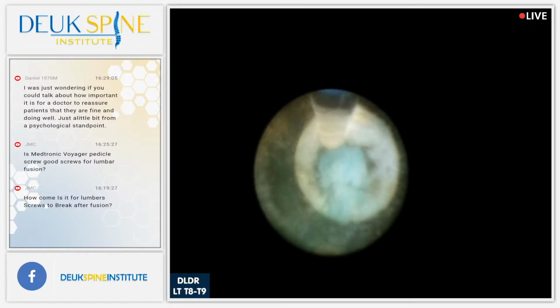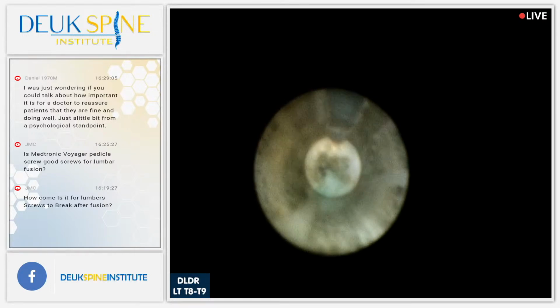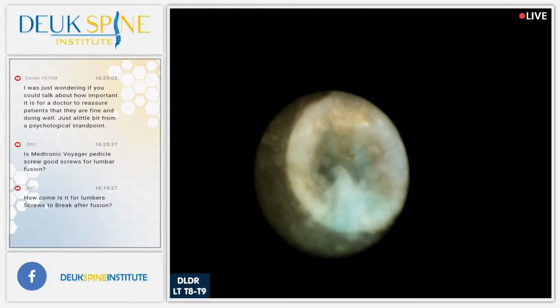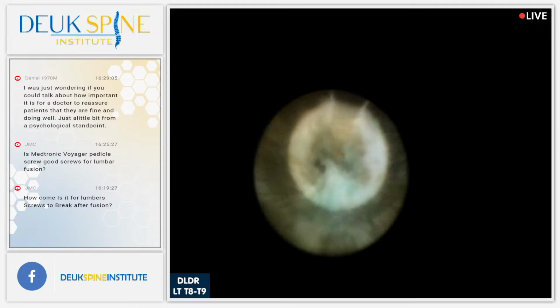You see the herniation right there? Yes, we do. Oh yeah, here it comes. So anyway, guys, why is the suction not on this bag? It's starting to pool, okay?